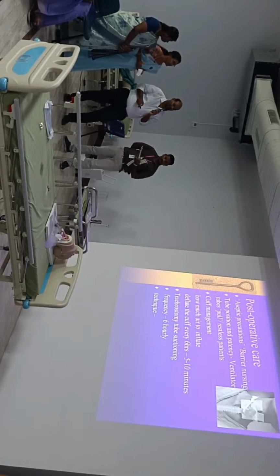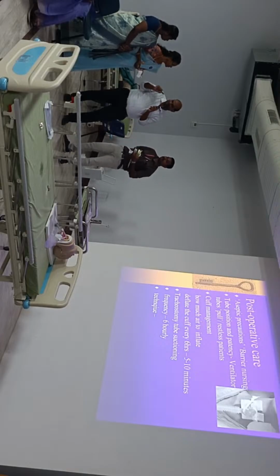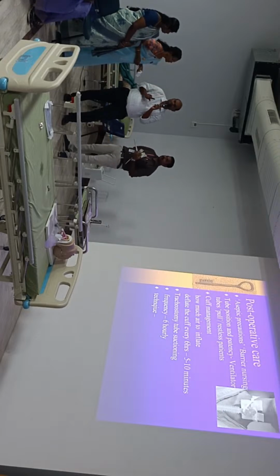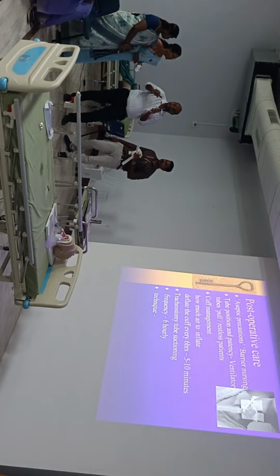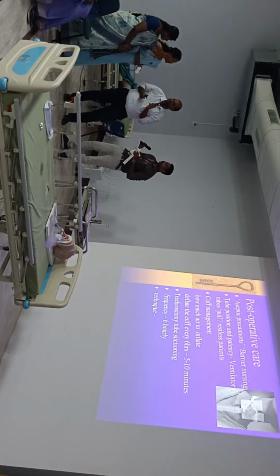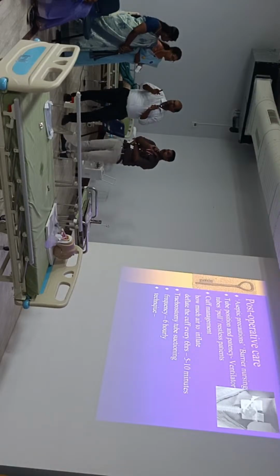So what is the technique of tracheostomy suction? We generally put a tracheal catheter inside the tracheostomy tube and then suck the secretion and put it in a saline. I hope that everyone is doing the same thing, isn't it? What tube is used? I'm just asking regarding the suctioning technique. What material is used? The suction catheter is made of a plastic tube, PVC tube.